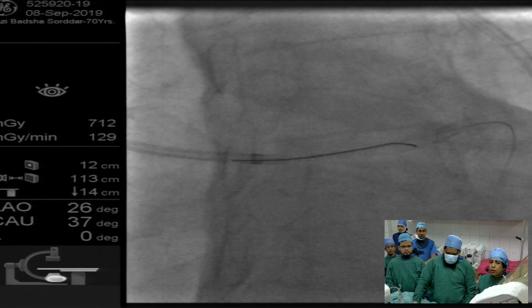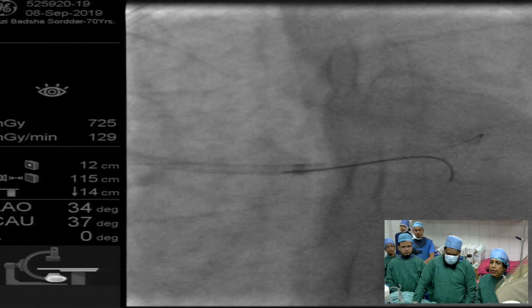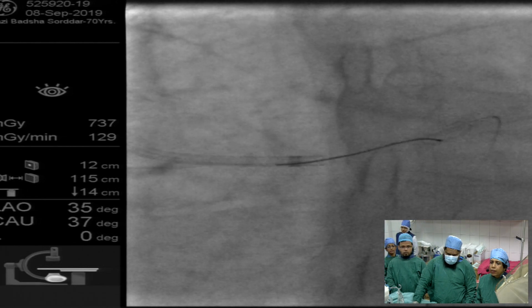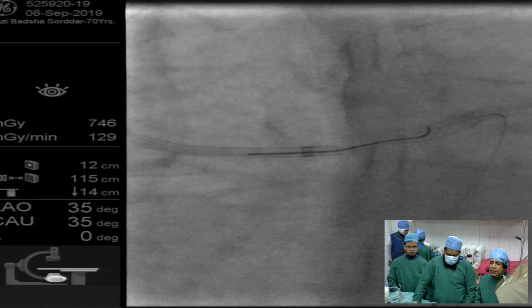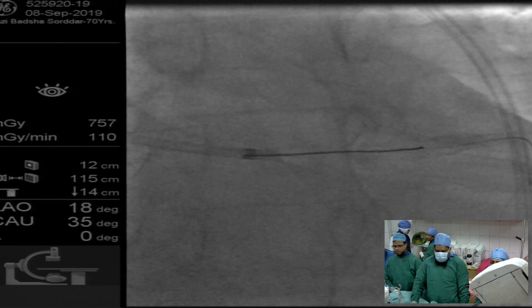So now it has to. So this wire I feel has not enough strength to go through 4 layers. If we had a micro, maybe it would have given adequate support, but this wire by itself is not going to go anywhere. It's too weak. It doesn't have the strength to go.